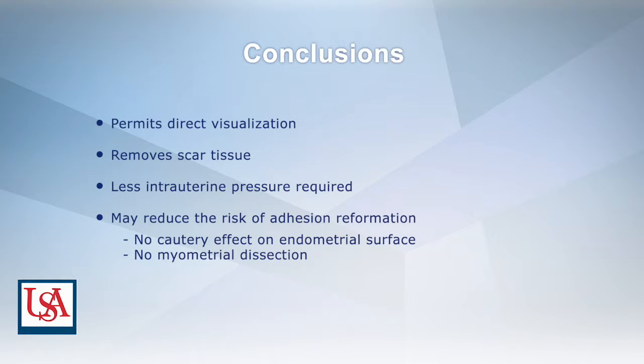This is the first case report using the MyoSure intrauterine tissue removal system for the treatment of intrauterine adhesions.